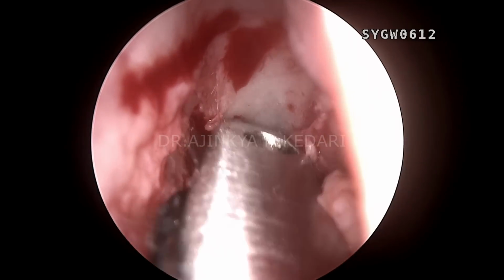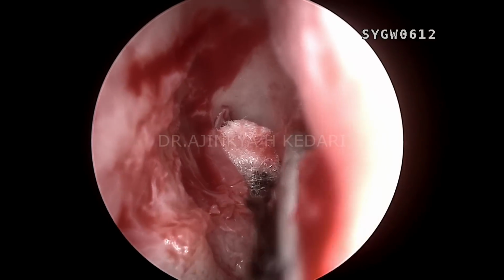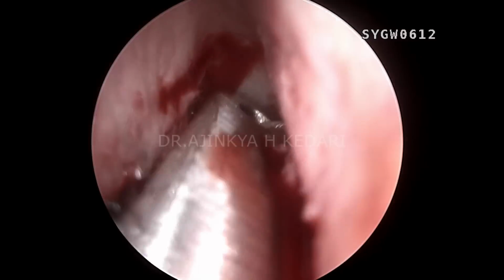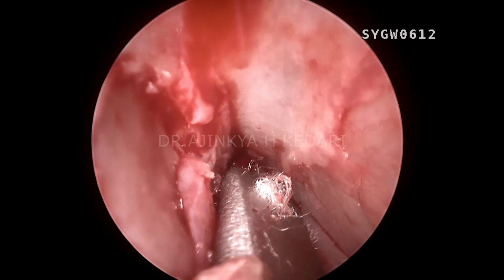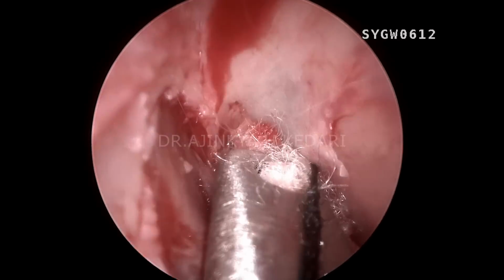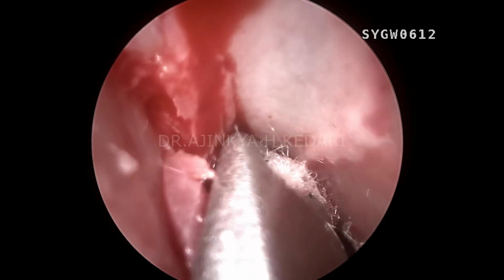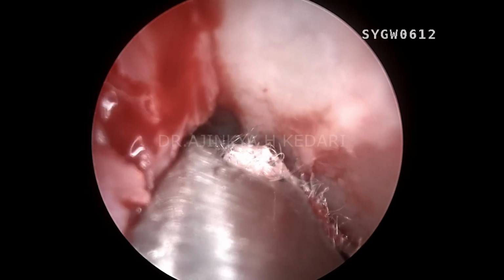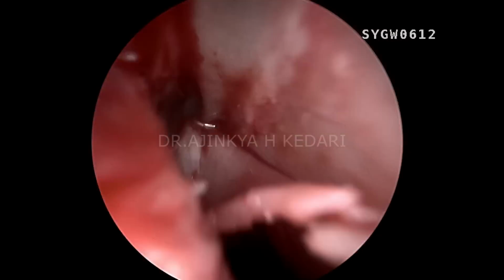You will see the very first structure when you take that mucosal elevation. The very first structure you'll see, more towards the lateral aspect, is the branch of the anterior ethmoidal artery. And exactly behind that, more towards the medial aspect, will be the first olfactory neuron. So that's the artery probably, and exactly behind that, more medially, would be the first olfactory neuron. I'm assuming this is the first olfactory neuron, what you can see right now, a thick white cord. That is how I could see the first olfactory neuron.